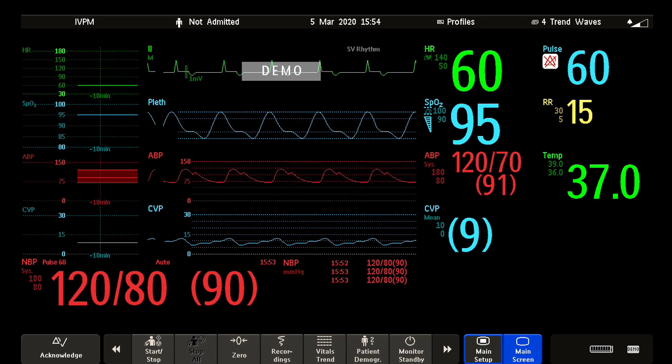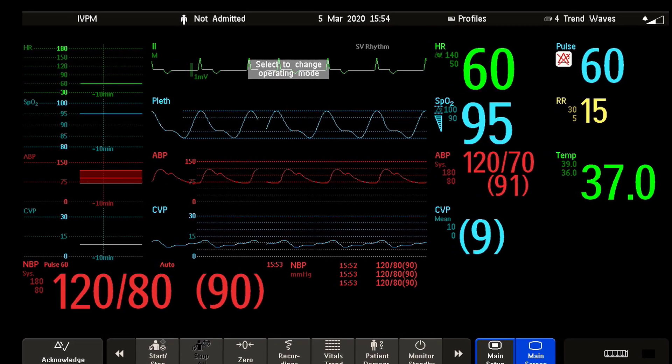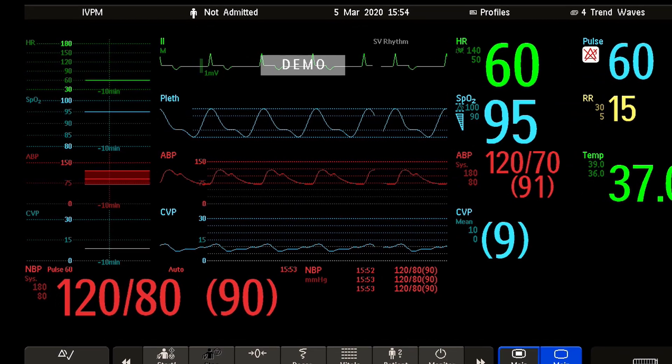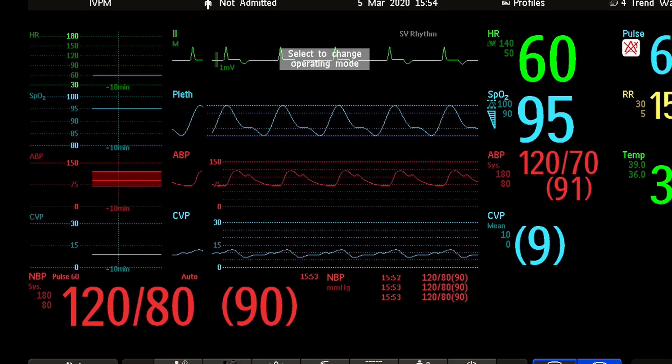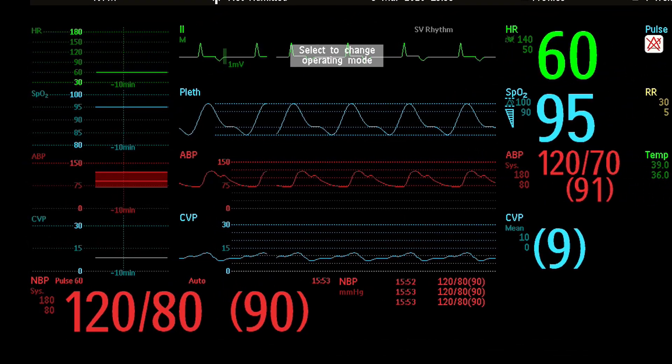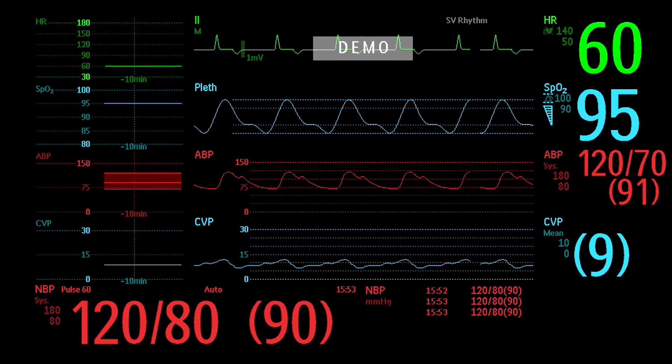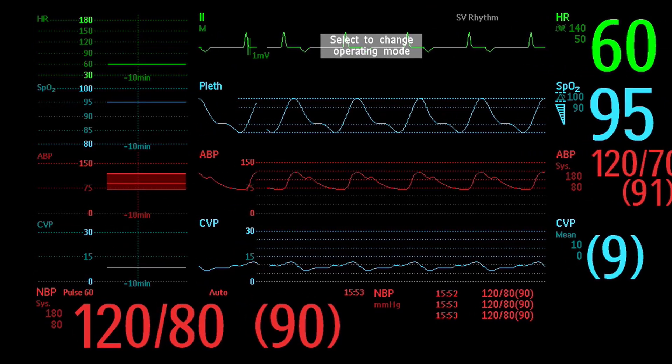Trends are patient data collected over time and displayed in a graphic, tabular, or histogram form to give you a picture of how your patient's condition is developing.